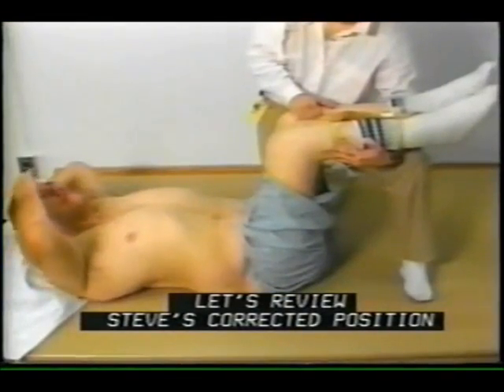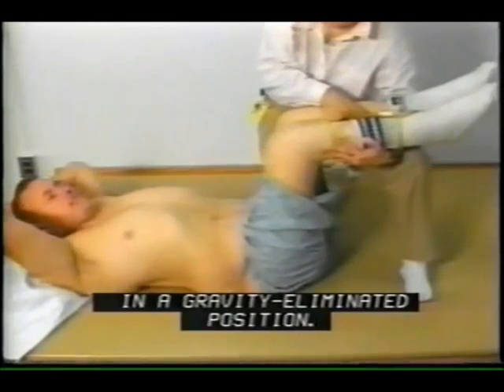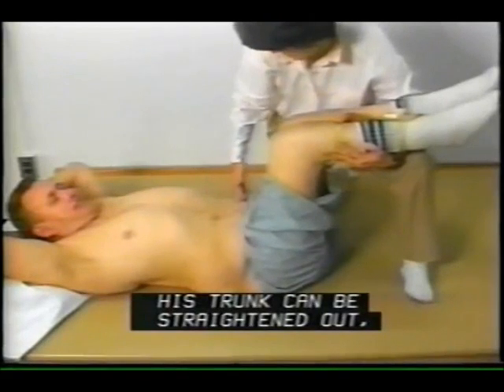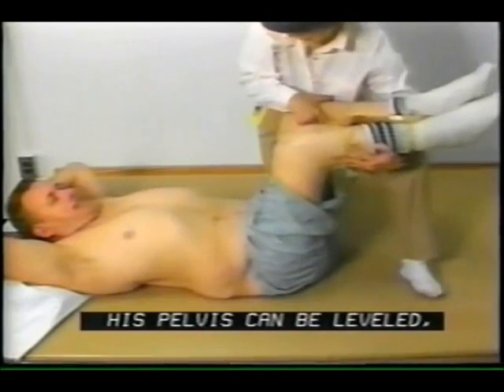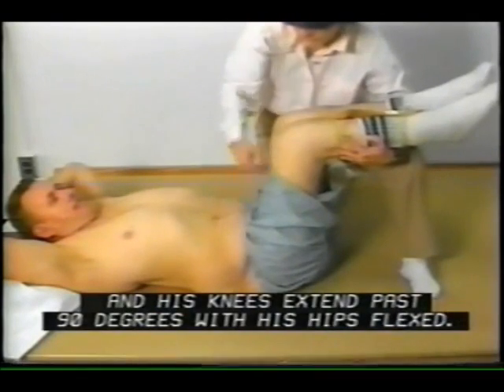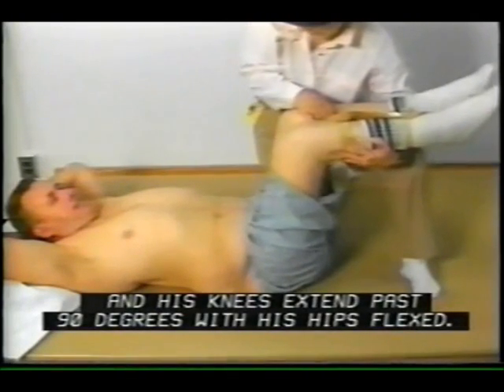Let's review Steve's corrected position in a gravity-eliminated position. His trunk can be straightened out, his pelvis can be leveled, his hips flex to 90, and his knees extend past 90 with his hips flexed.